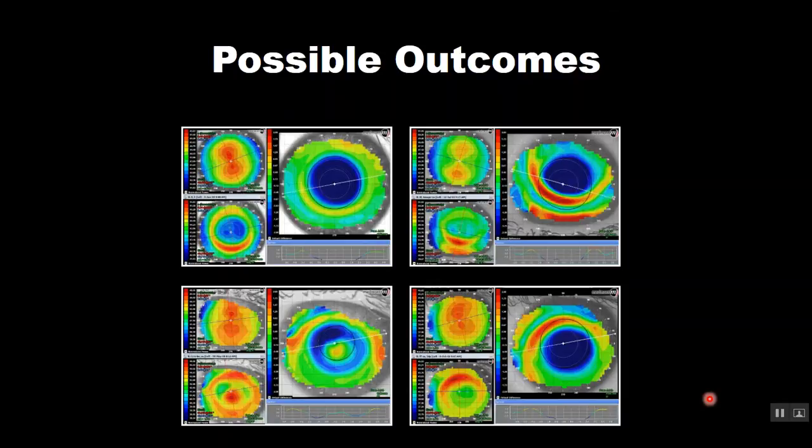Now, when you do orthokeratology, it's helpful to know that you can really only do 4 things. You can get it right, we get a bullseye. You fit it slightly flat, we get a smiley face, we get a high riding treatment zone. You fit it steep, we create apical steepening, possibly associated with a little bit of inferior decentration, we get the central island. You fit a really well constructed lens, but ever so slightly tight in the alignment zone, and it may ride a little bit low. We get what's called the frowny face.